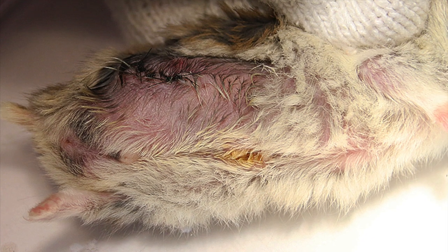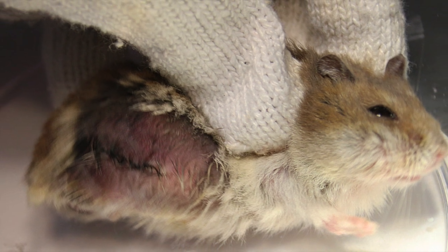After the leg is amputated, the surgeon will suture the muscle and the skin back up. Here is how the hamster looks like after the amputation and the suturing.